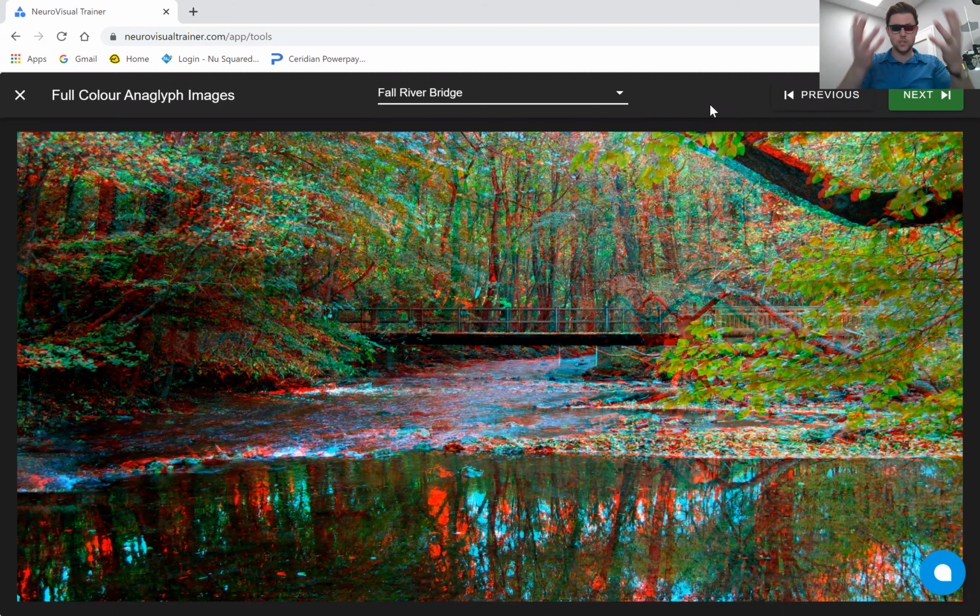And then as the patient is viewing here, it's actually really fun to play with. You can certainly, again, I know that they mentioned their doctor accounts are free, so you're welcome to play with this a little bit in office. You can see what I'm looking at here is I can see depth within the trees. I can see the bridge off in the distance. I can see the angle that it's taking as it moves across the river. It actually looks very, very cool.